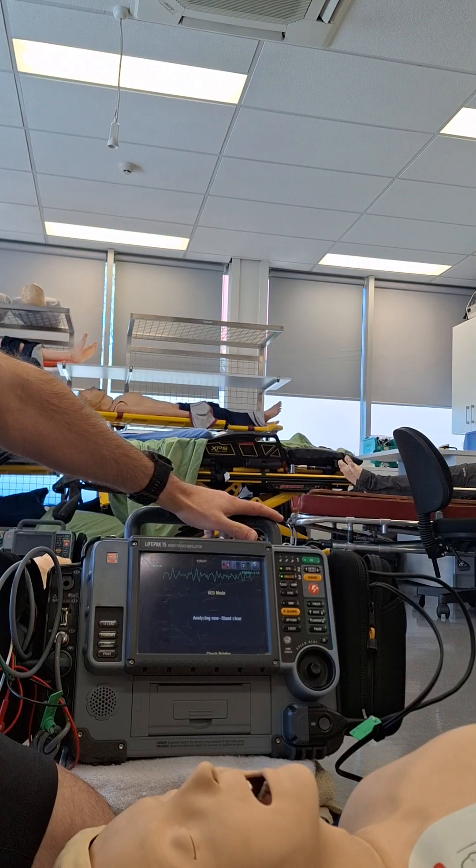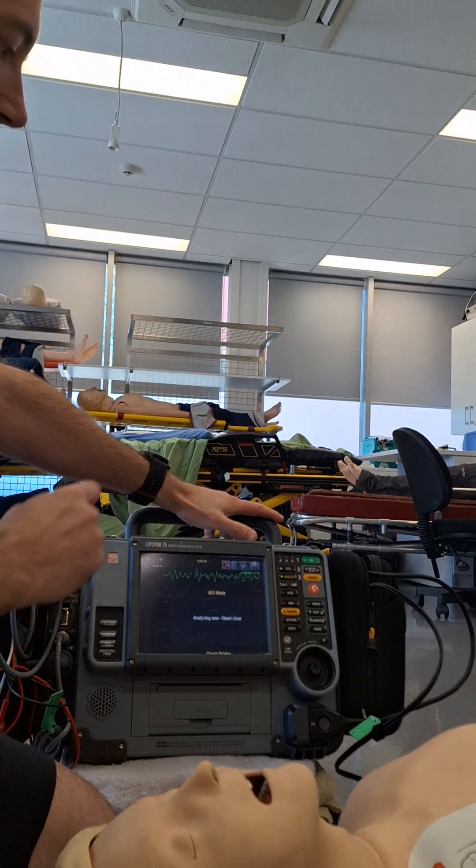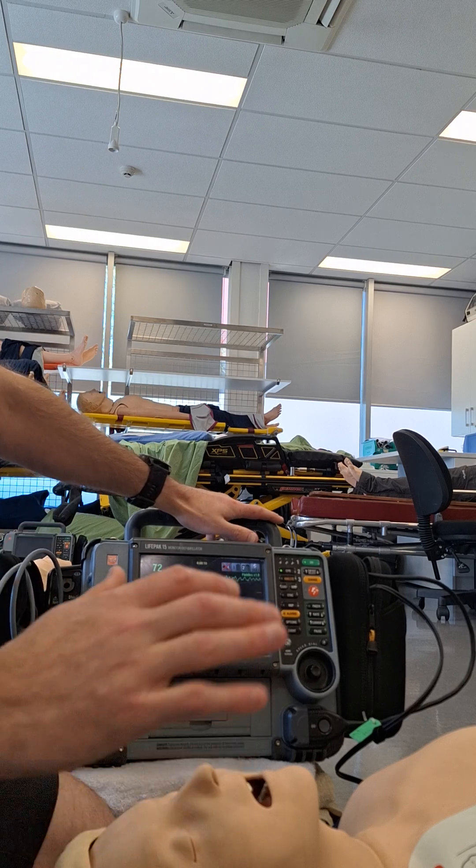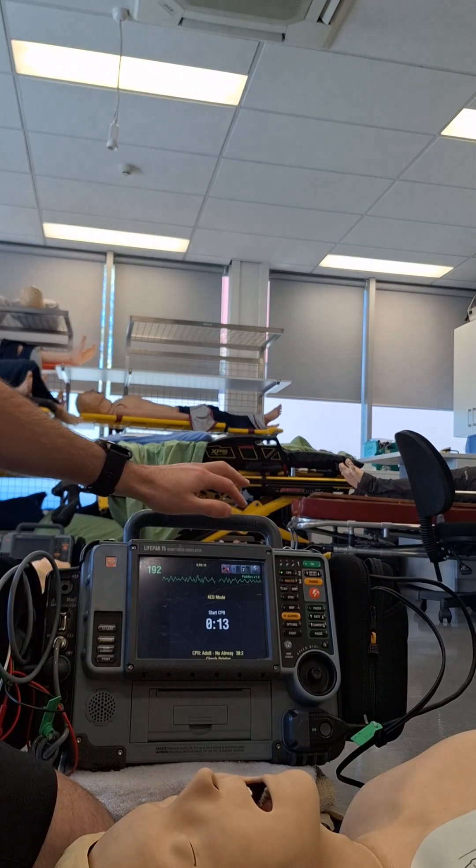We're going to pause our chest compressor. We're going to have a look at what rhythm we're seeing here. We've got a ventricular fibrillation. And once the monitor has analyzed, we can go back into doing our chest compression.